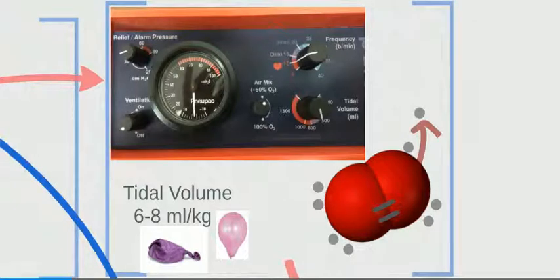And I took those from a range of books, and it was actually passed down from our medical director to keep it at that, and actually start at the lower number. Start at 6 ml per kg, then go up to 8. One thing I'm going to advise you guys right now is don't set your ventilator to a normal standard. Don't set it to 400 tidal volume, because I want you guys to be breaking out the calculator and using your minds on scene, not just setting it to some random number like 400, which isn't going to be the same for all of your patients.